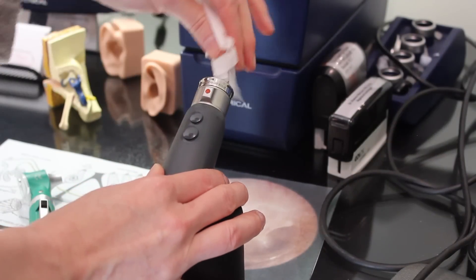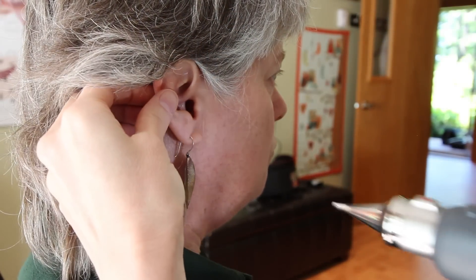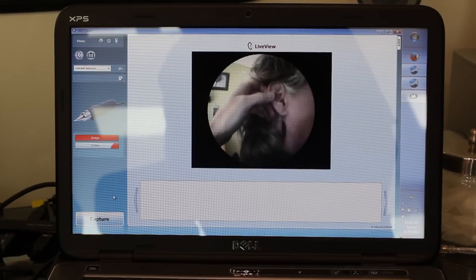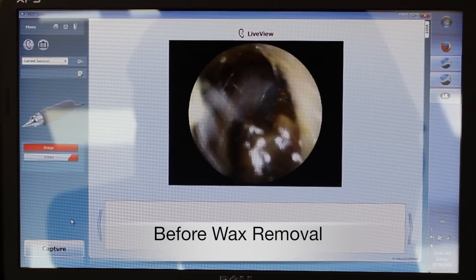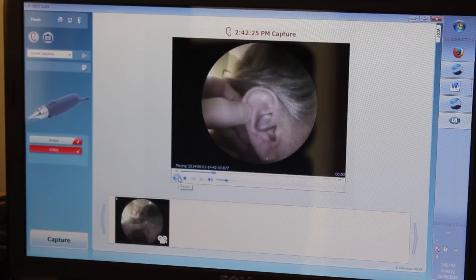Dr. McClain uses a small video camera to look inside the ear canal and to inspect the eardrum. Images recorded before and after the procedure show that the excess wax has been removed and therefore the client's hearing has improved.